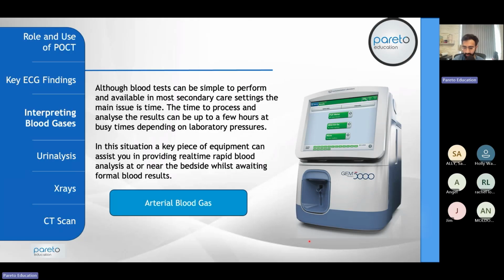Sepsis, no doubt. Any others? Looking for potassium or lactate? Yeah. Yeah, so it does give us some immediate answers, really. And a venous blood gas can also do the same. You may even want to use it to monitor.